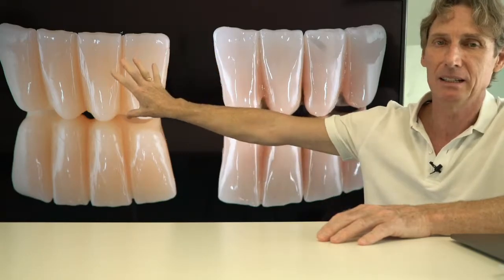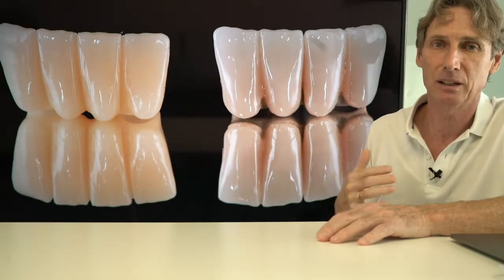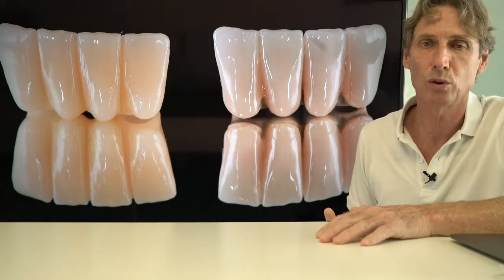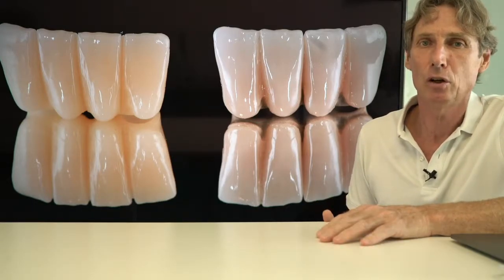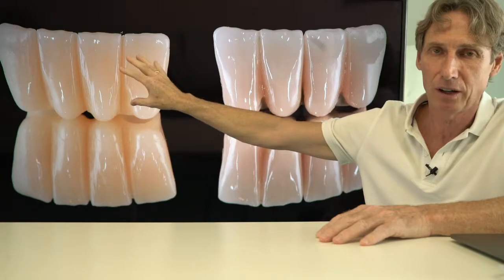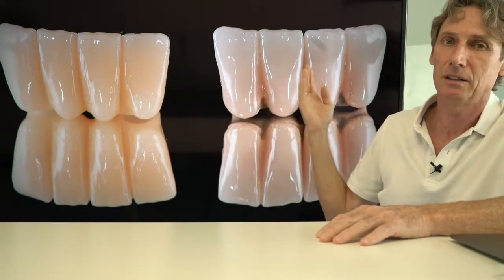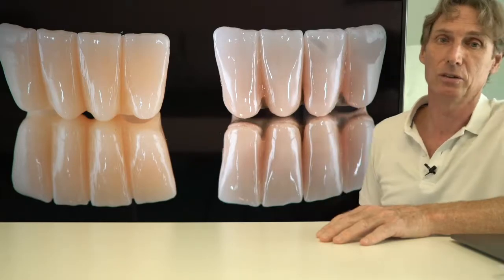But now, with the SIEWERT screw and the SIEWERT STL file, we are able to make a PMMA bridge, and here in this case it's the frequent situation that we have to take out the 4 inferior incisors. We do direct and immediate implantation of 2 implants, and then we want to have an immediate loading by a provisional bridge, so we can do it nicely and very fast. And if this bridge shows that everything is perfect in the mouth, it's very easy to copy this shape to a definitive bridge with the PEEK framework and the zirconia crowns.